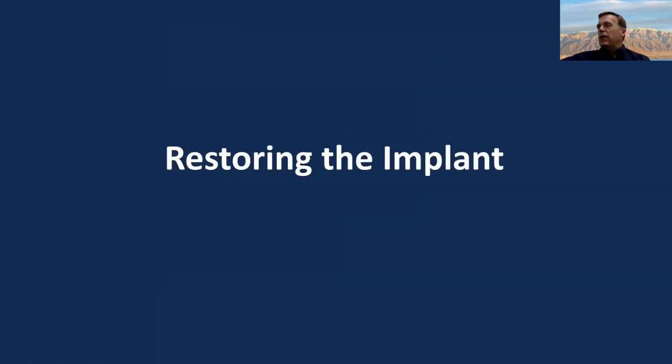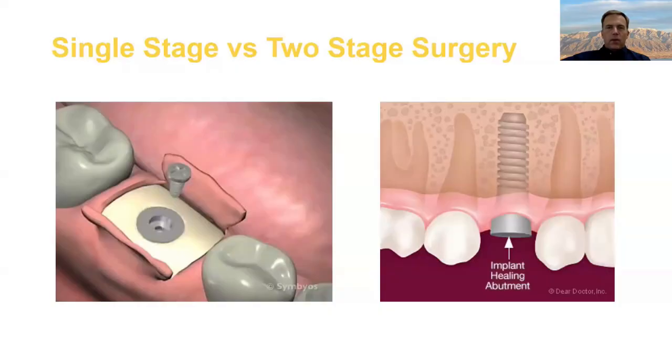So we've kind of talked about getting the implant in there, doing the provisional. So now let's talk about, once the healing's done, what are we going to do?